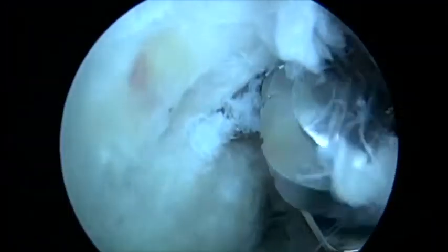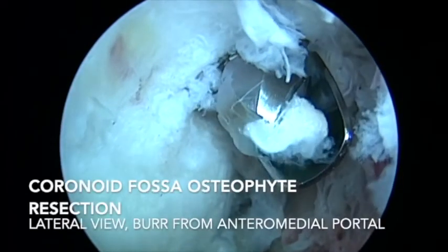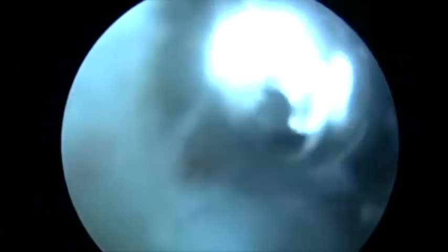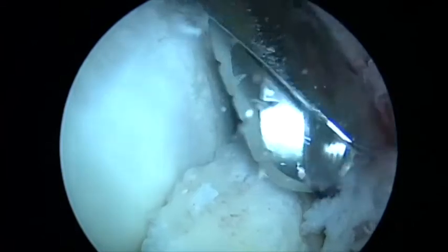Then we resected the osteophytes of the olecranon and the olecranon fossa. It's very important in these cases to perform a 3D pre-operative CT scan to study where the osteophytes are located that we are going to resect during surgery.